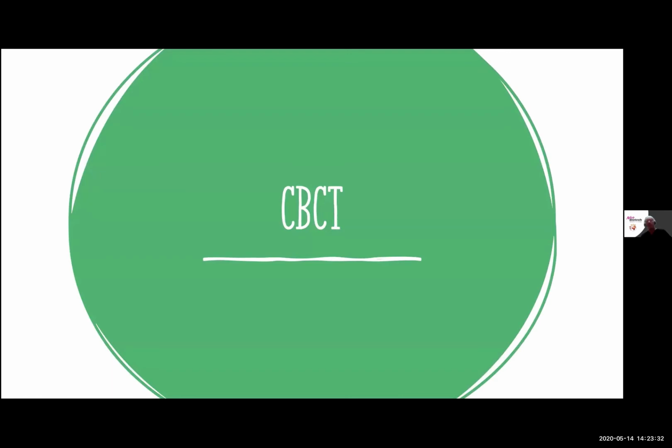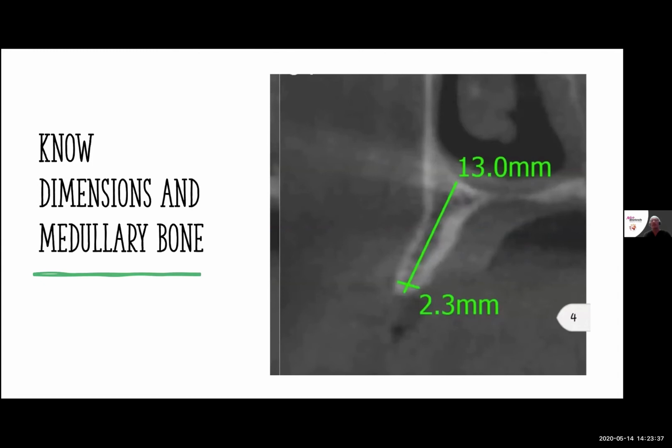And so we first start off with the cone beam. The cone beam itself is going to give us the example of the ridge and what we're looking at with ridges. We've seen lots of ridges just like this. If we have this height that's here, we're amazing, and this is great. If I can get a height that is this amount or implant length, then at that point, this is a slam dunk case to grow bone here on the outside, and literally to grow what I call an exostosis, or grow tori in the area where I need to grow tori.